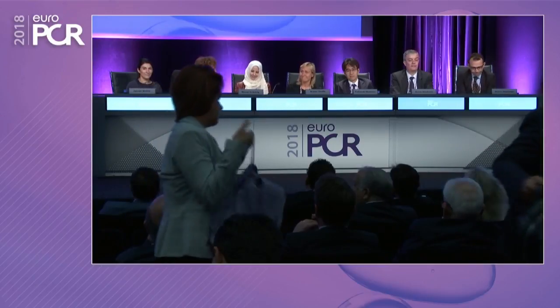And I think that's a very important message when you have superposition, to be sure of your diagnosis. Second, they insisted many times on the use of non-compliant balloon for post-dilatation and explained why it is important to be very precise and effective with non-compliant balloons.